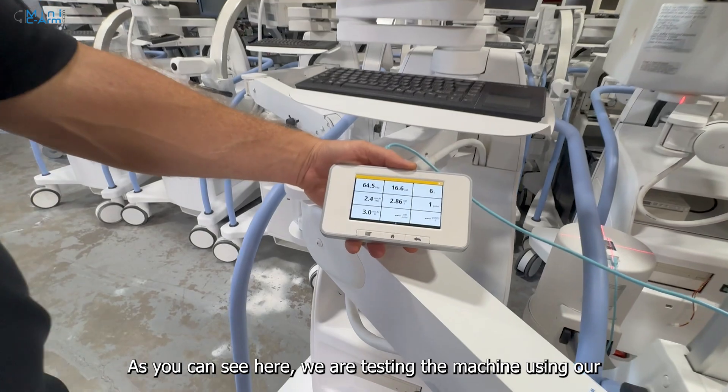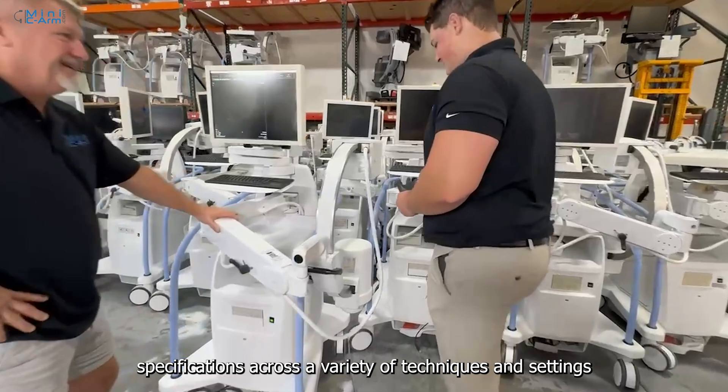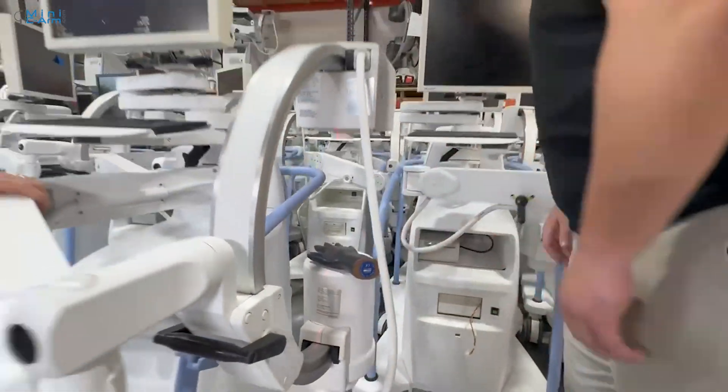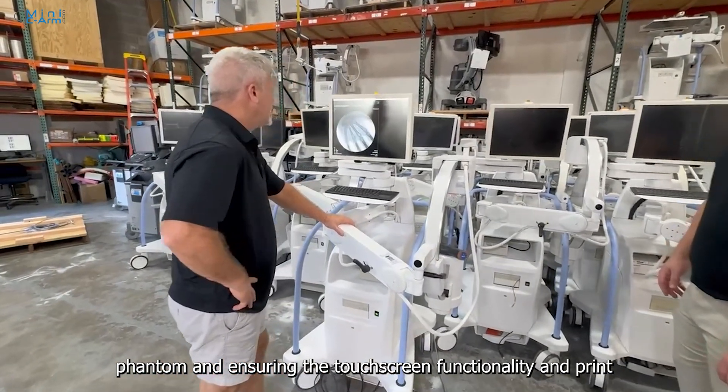As you can see, here we are testing the machine using our specialized radiation meter to ensure it meets the manufacturer specifications across a variety of techniques and settings. Next, we are verifying image clarity using our cadaver hand phantom.